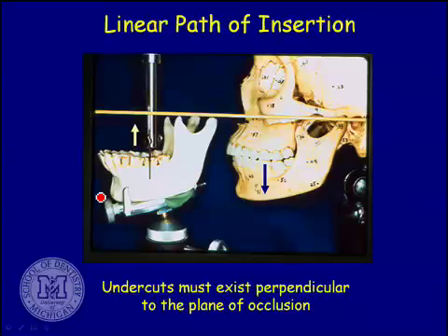Many times, if they lean lingually so that the lingual of the tooth is in the way, what do you suppose is the situation out at the buccal of the same tooth in terms of undercut for your clasp? It ain't there. Everything's leaning lingually. So you're just looking at the orientation of the teeth when we've got things oriented, when basically our casts are level front to back and level side to side.